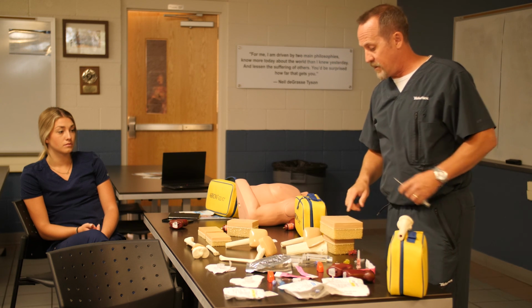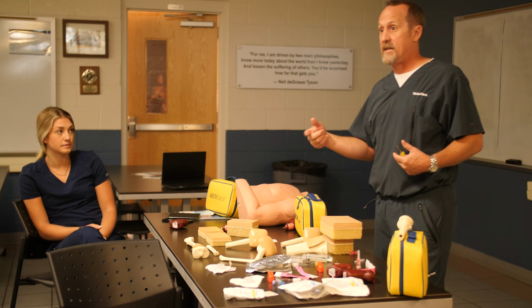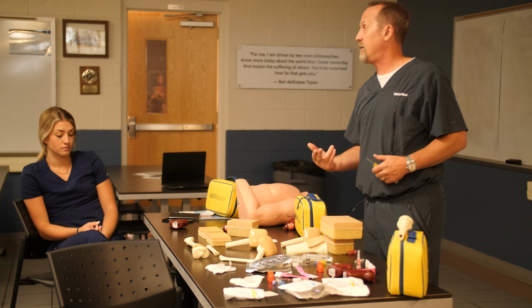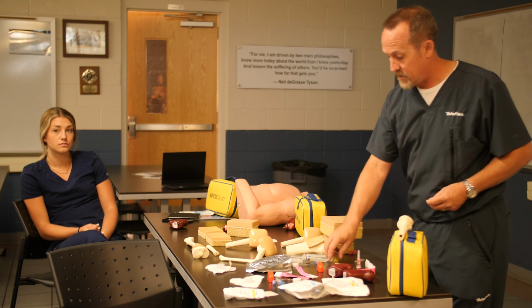After we've removed it, you can put a Band-Aid over the skin. It's not like a vein where it's going to seep and ooze and leak. Put a Band-Aid over there, it's going to protect that little insertion site. The bone's going to heal up on its own within 48 hours. Any questions?